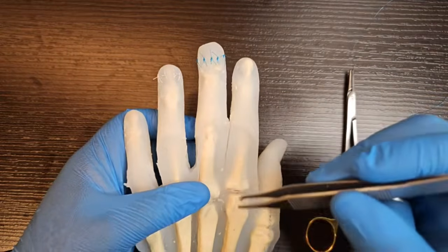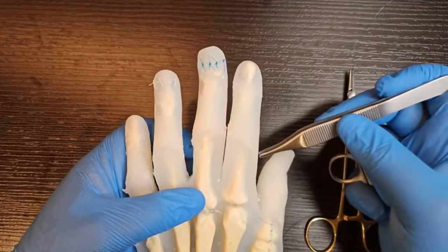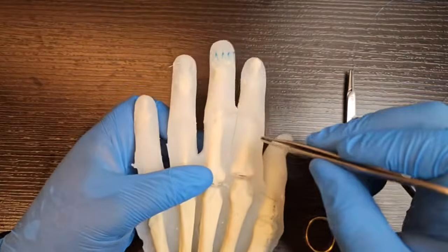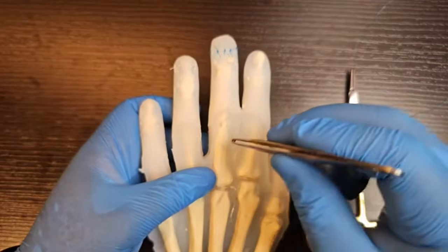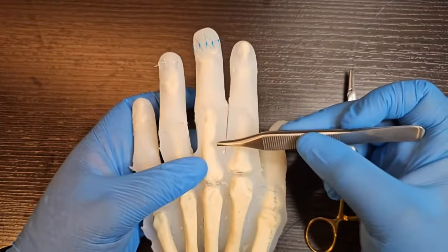The patient's awake. I tend to start on the dorsum because it's less painful than going through the thick glabrous skin on the palm. I put a bleb in the skin here, so I go either straight down, or if I'm sitting on the side, just under, into the fat, not into the dermis.